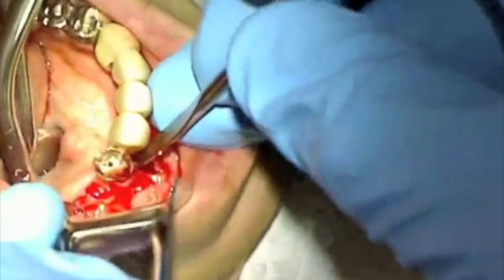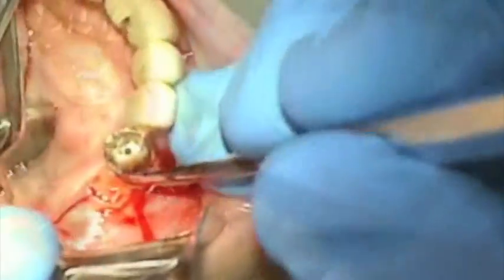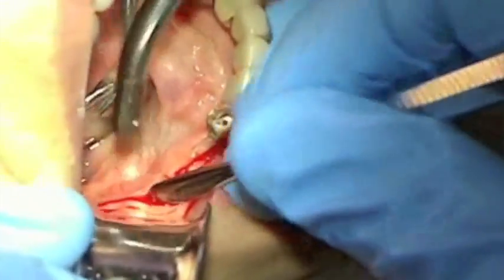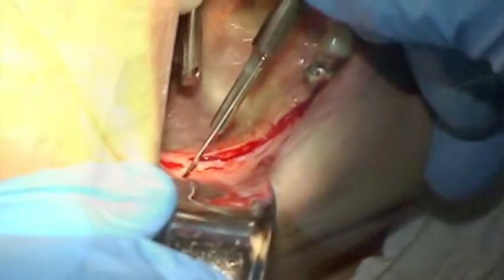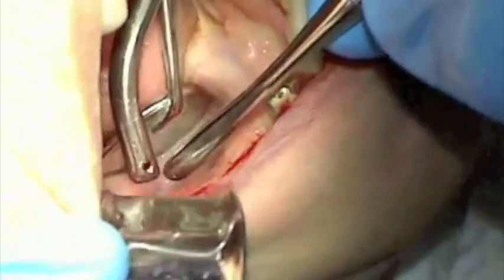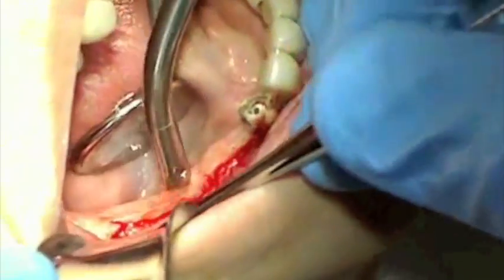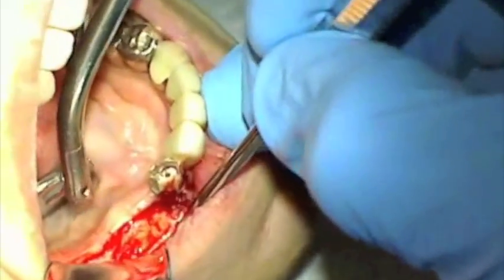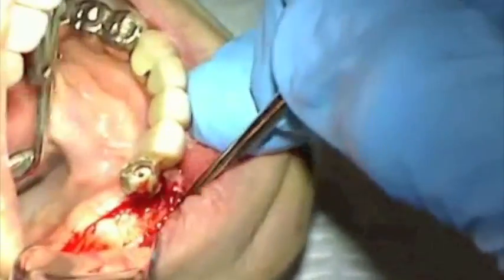Firm pressure with the periosteal elevator against the bone carefully dissecting the periosteum will avoid damaging the nerve and its contents, as the nerve and its sheath becomes continuous with the periosteum. A deep releasing incision lateral to the initial incision will help prevent tearing the tissue while full thickness reflection is completed. Careful dissection of the periosteum in the vicinity of the mental foramen will prevent damage to the nerve.